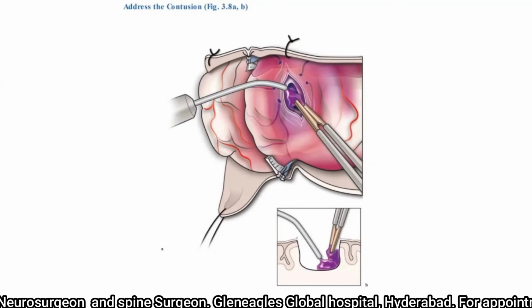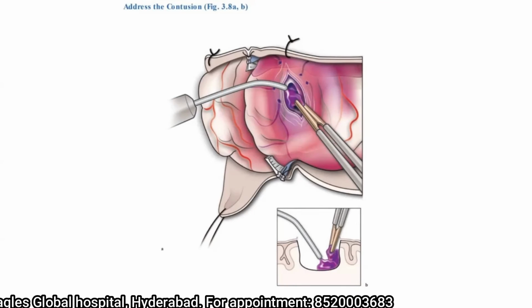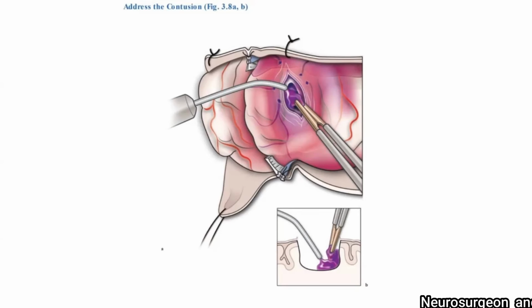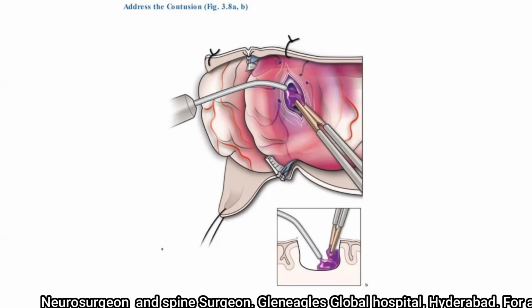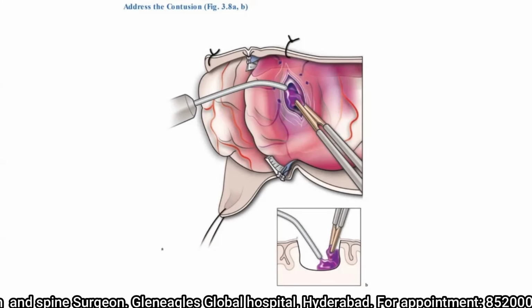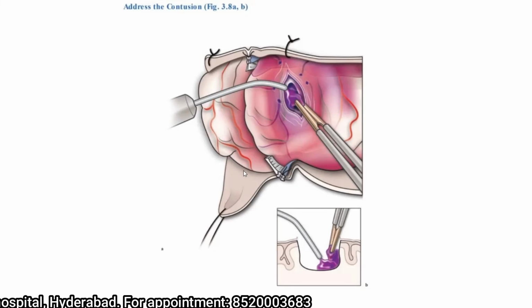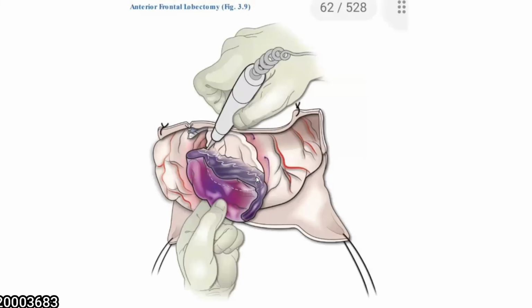Now coming to the evacuation of the contusion, this is similar to the evacuation of the temporal contusion in my previous session. So for people who have not attended my previous session, I request them to go back to my previous session on my YouTube channel. There I have clearly explained how to remove a contusion. It involves first, identification of the contusion, cauterization of the superficial pial surface. In the subpial plane, reach the contusion, then evacuate the liquid and solid components of the contusion, and achieve hemostasis.